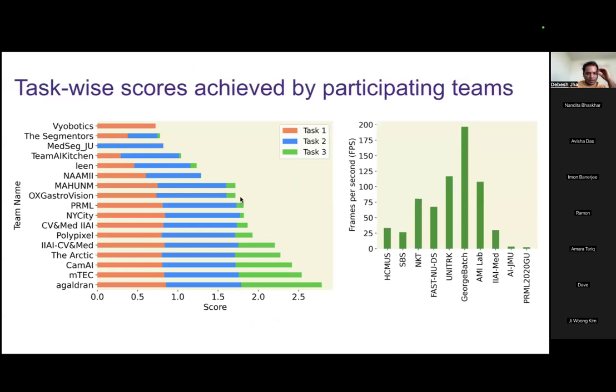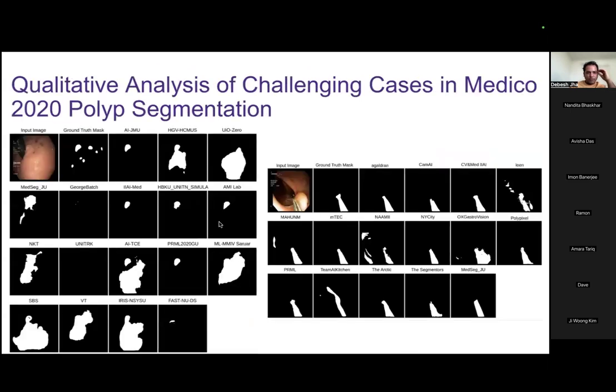And then here you can see we also evaluate all of this, and then we rank first, second, and third. And then we also make analysis, for example, where models fail. So this is a failure case. For example, here you have some small polyps. Even here clinicians fail for this kind of cases. Even if you see all the models, they fail to detect this kind of cases. Which means there is still some effort required to solve this task.